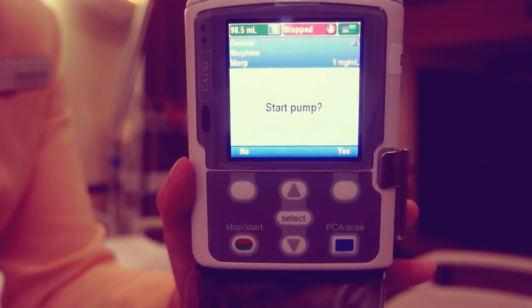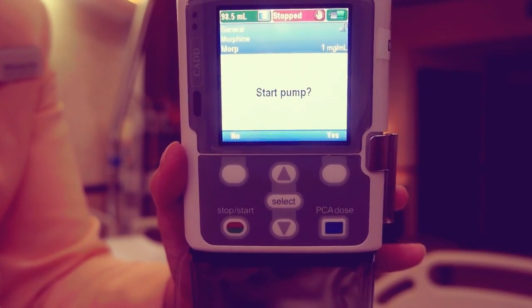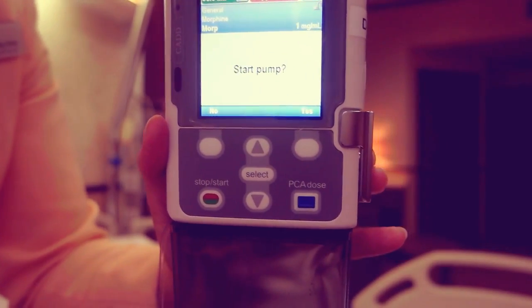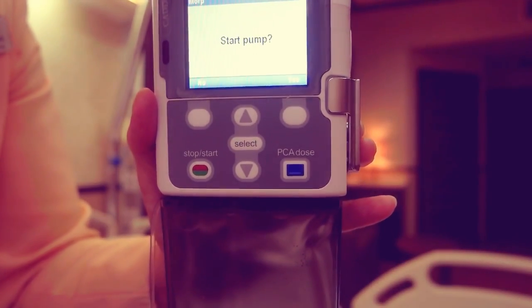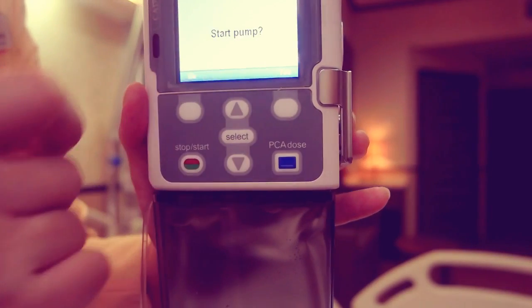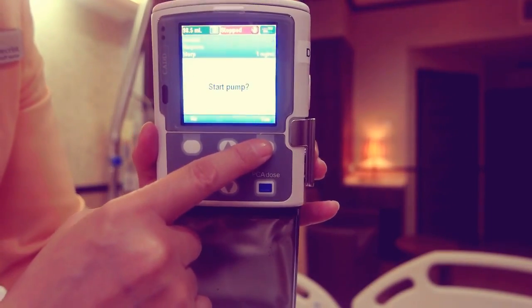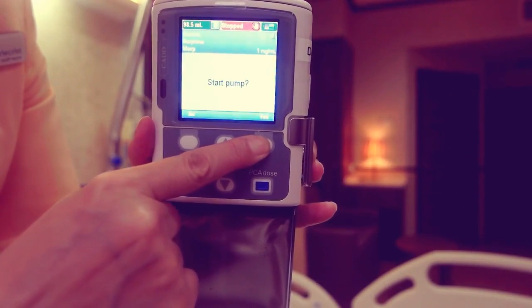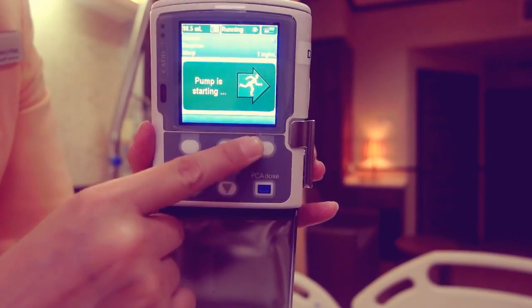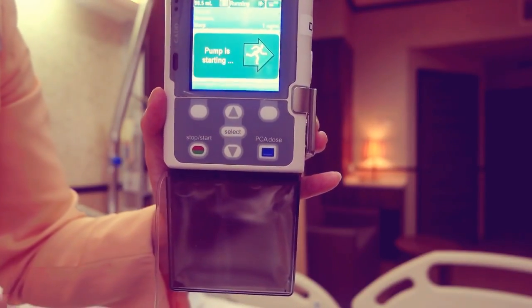Start pump prompt displays. Press yes when you are ready to begin the infusion. The pump begins running.